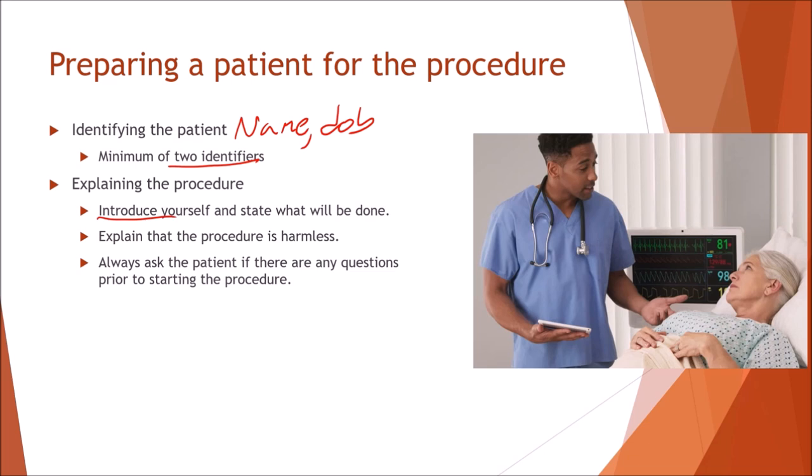Now, another thing you want to do is explain the procedure, and you always want to introduce yourself. So you want to say something like, hi, my name is Jose Rivera, and I'm the medical assistant. I'm going to be taking an electrocardiogram, or an EKG. An EKG is an electrical activity of your heart. What I'm going to be doing is placing a bunch of wires on your chest, which might take a while, and then I'm going to be taking the image itself. I ask that you please undress from the waist up. Do you have any questions for me? You always want to finish by asking the patient if they have any questions.